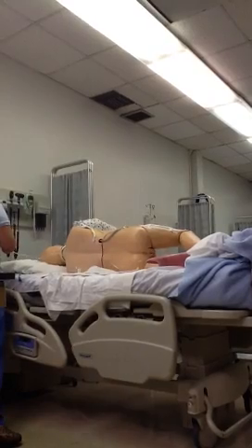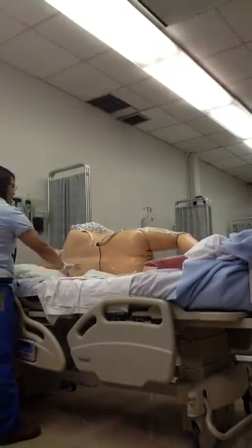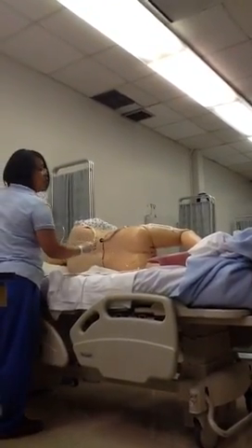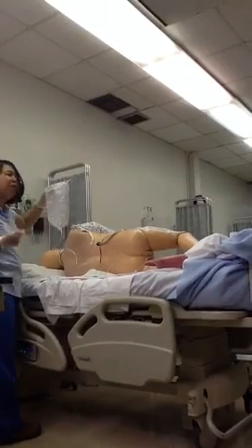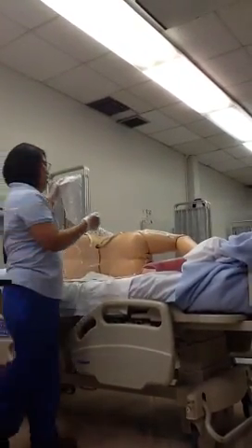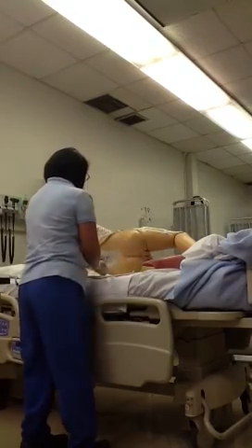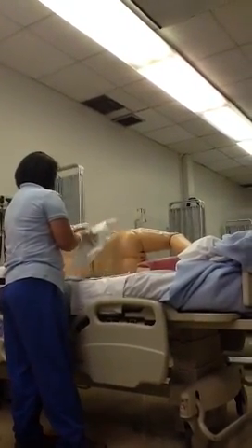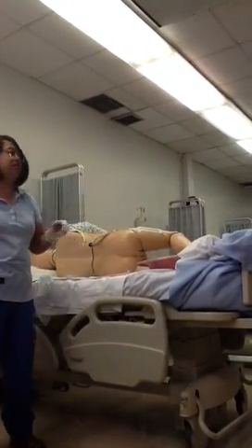Once that, let's say that all 500 cc's does go in, then you go ahead and clamp it before you take the tube out. Let me say that again. Clamp it before you take the tube out, okay? You're going to take this tube out, all right? I would wrap it around, if you have this top sheet, I would wrap it around this. This goes in biohazard, right?